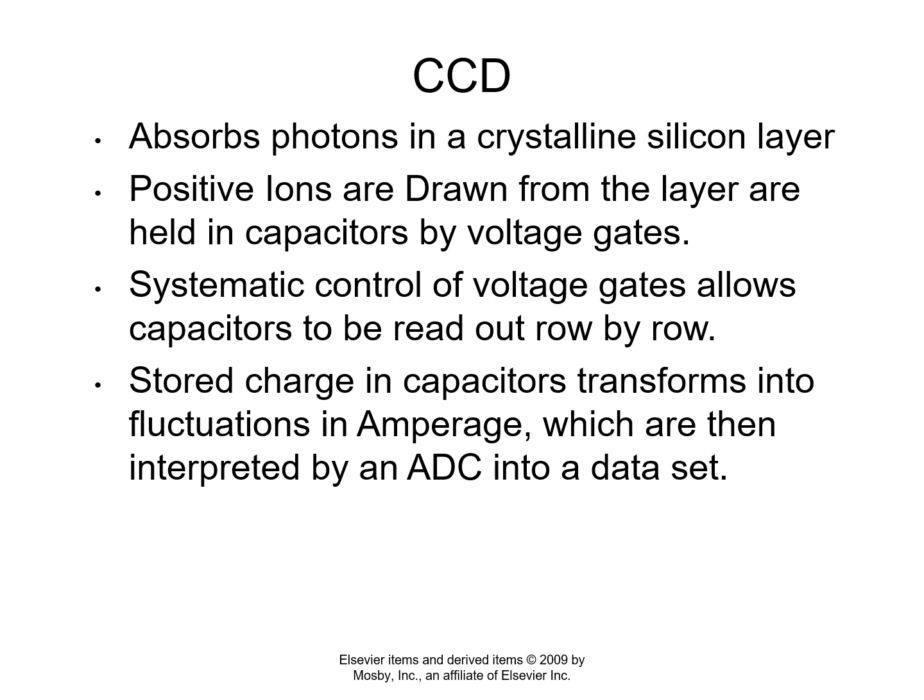Dependent upon the environment, when you have beach sand out there, the beach sand is doing this. The beach sand is participating in the photovoltaic effect. But what happens is the electron just grounds back out to the positive ion. But if you have this wafer of silicon where you have a layer on top of it that is like an anti-static layer, that's the dielectric layer, it can actually pick up and absorb those loose electrons before the silicon has a chance to self-neutralize again. Okay? And that's the science of a solar panel, and it's also the science of a CCD.